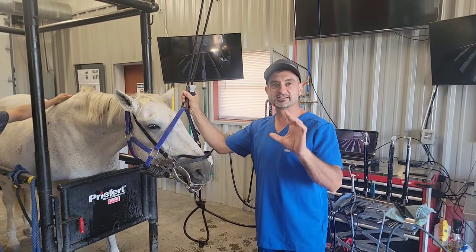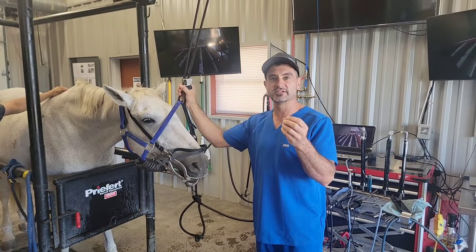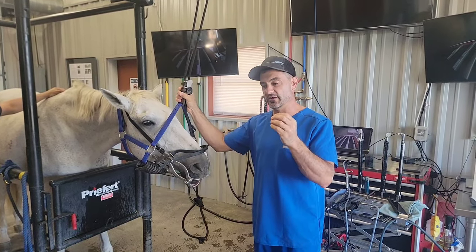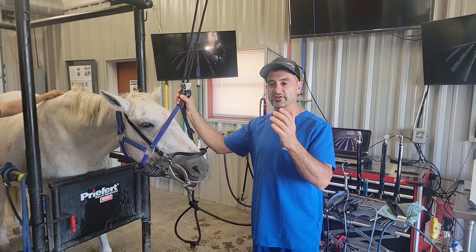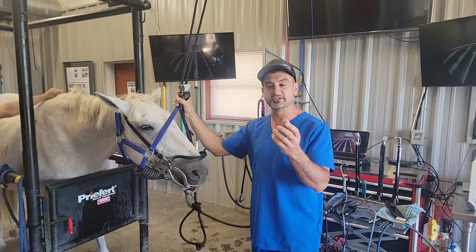In this video, we'll show you guys how you can be really efficient with certain techniques. We have some minimally invasive techniques that are really rapid and atraumatic, even on what would seem like really challenging cases.